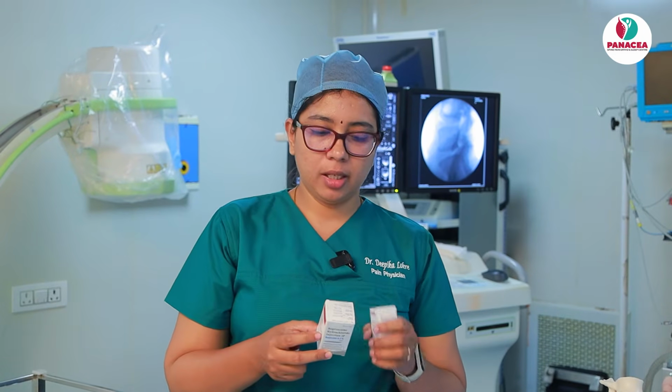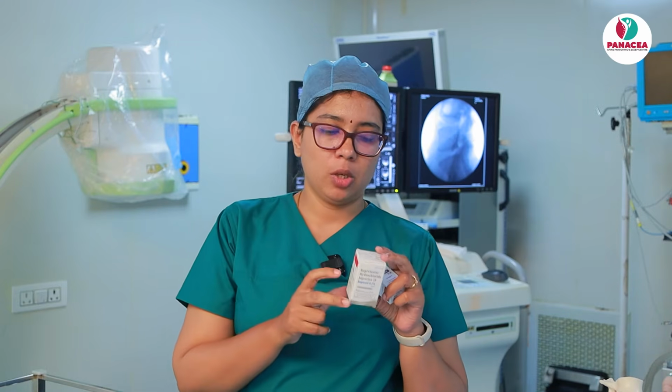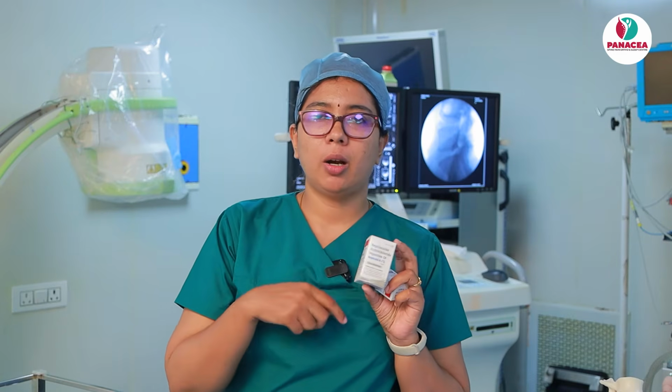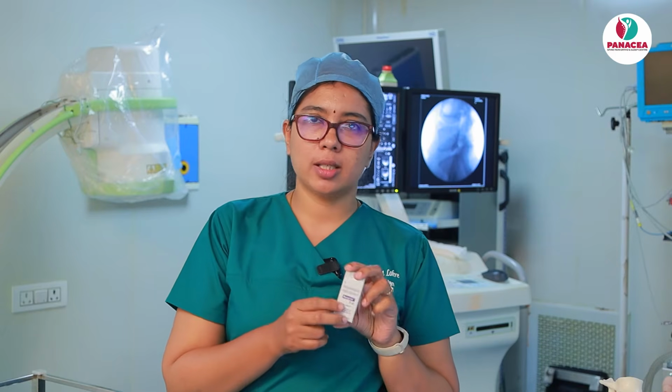So next is the drug which we are going to give to the patient, and that can be any local anesthetic. What we usually use is a sensory dose, that is a very low dosage, so that only the pain reduces. So ropivacaine 0.2%, this is preservative free, or you can also give bupivacaine 0.25%, that is also preservative free. So this along with the steroid is given.